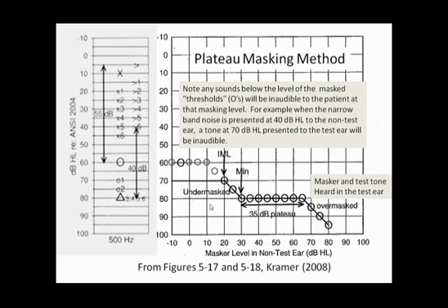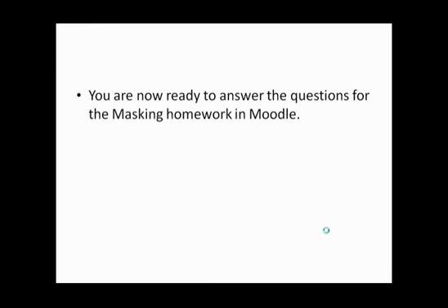And just so you know, this graph right here with the masking plateau is not actually used in the clinic. Audiologists do all of this in their head. So we just do this in our heads as we're doing this masking protocol. Can we forget where we are if we get distracted? Yes, that happens all the time, and then we have to start the masking plateau over again. So that's the masking plateau method.